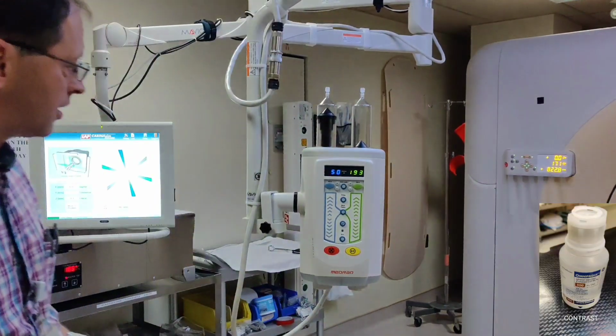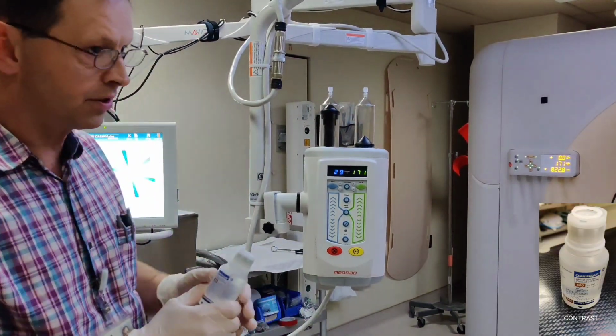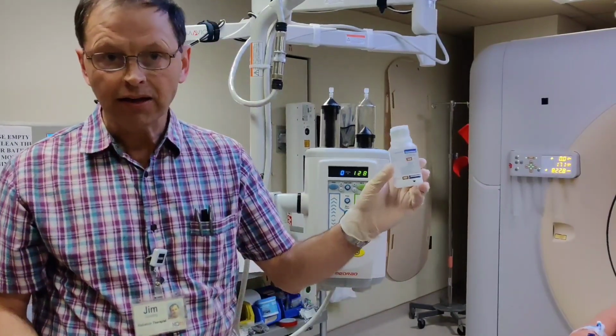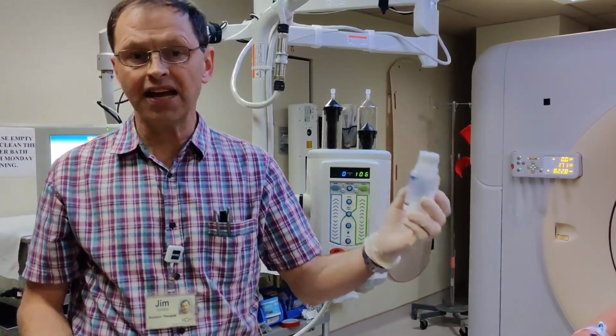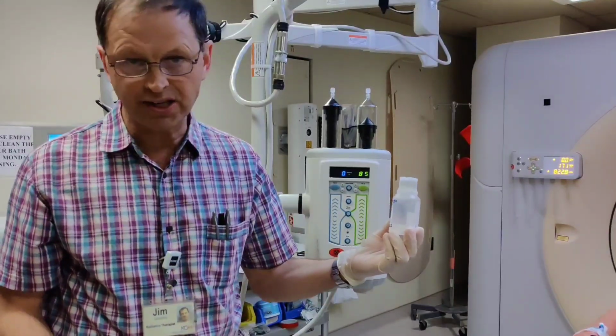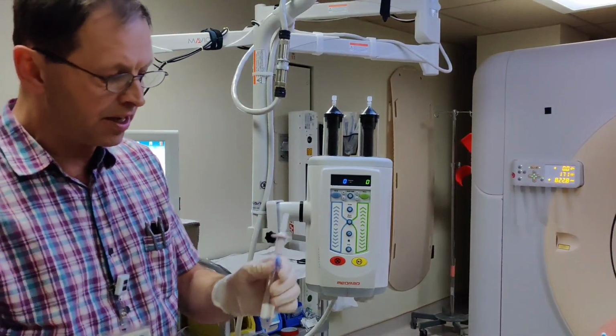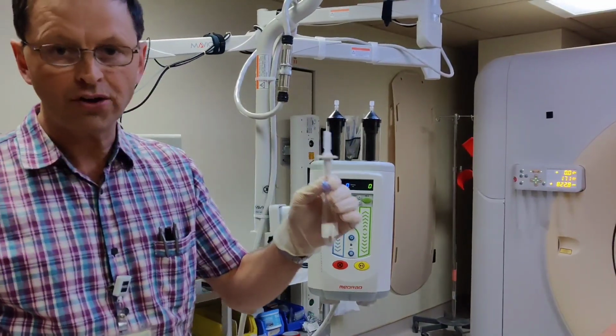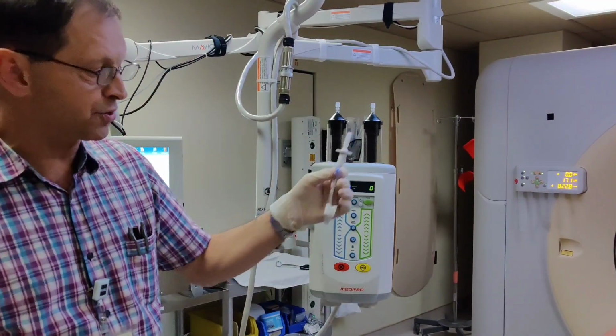Next thing I'm going to do is I can choose to load either contrast or the saline. So I've got my Omnipaque 100 ml bottle. It should have been taken from the warmer. We want this to be body temperature. The other thing we're going to need is these spikes. The spikes are the way that we get the contrast from the bottle into the syringe.